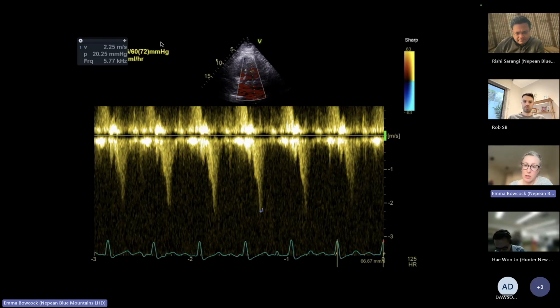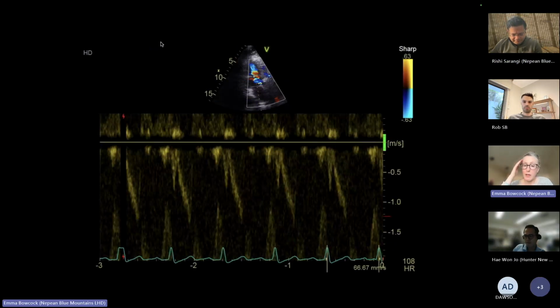So doing all the things as you mentioned to try and alleviate that: minimizing beta agonists, giving fluid, keeping his afterload up, pain control. You're absolutely right, all the simple things, which is what we ended up doing because he had an ischemic left leg, and he was still in a lot of pain for that, so just switching around his pain relief and things.